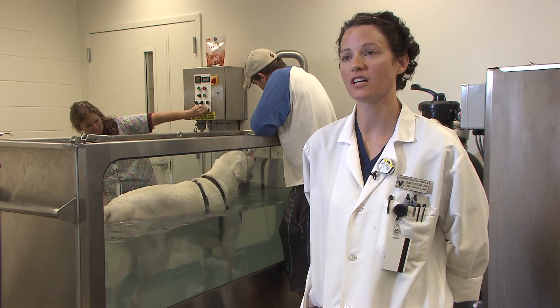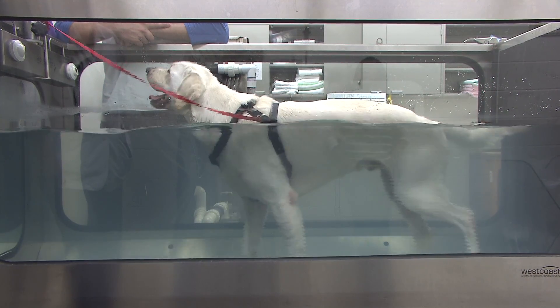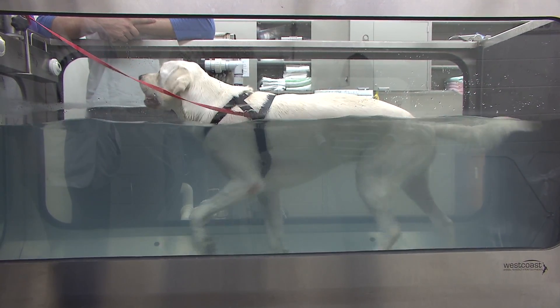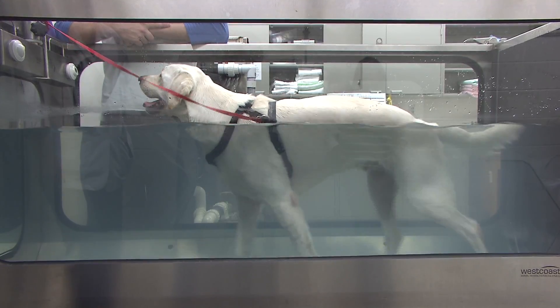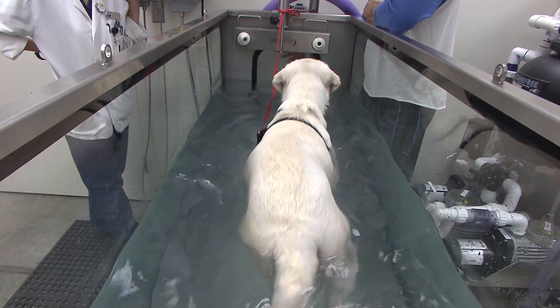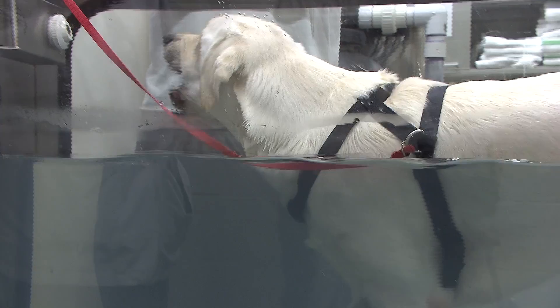The underwater treadmill is used for various things. The general properties of water make it a really beneficial tool — we keep it pretty warm at 81 to 82 degrees, so it has nice thermotherapy properties, which is great for sore muscles or arthritic patients like Baxter. It also takes all the weight off stressed joints and provides buoyancy so they can use their limbs. In the water they feel more comfortable and we get really good strength training.